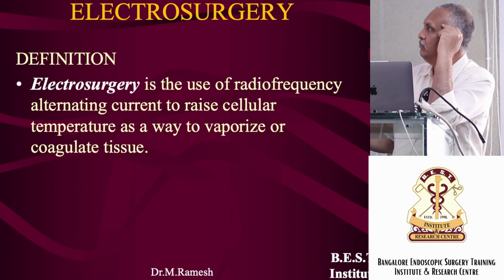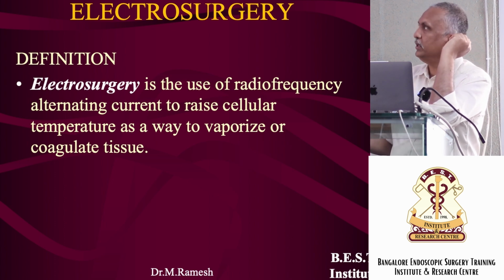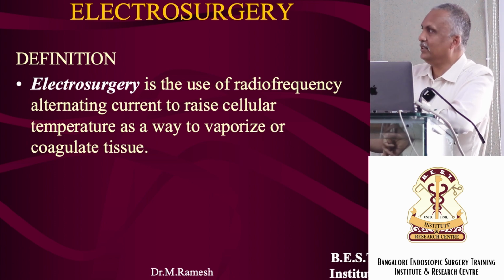Then you should know why this radio frequency alternating current raises cellular temperature, and if it raises the cellular temperature, when does it vaporize and when does it coagulate. So the whole lecture is about this. Okay, the definition. We are only explaining the definition.